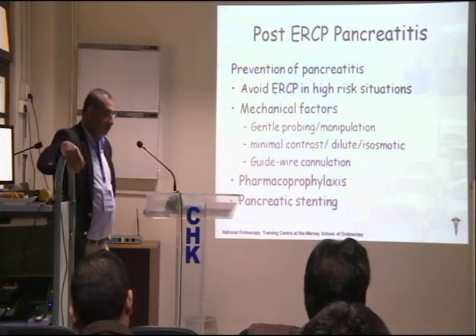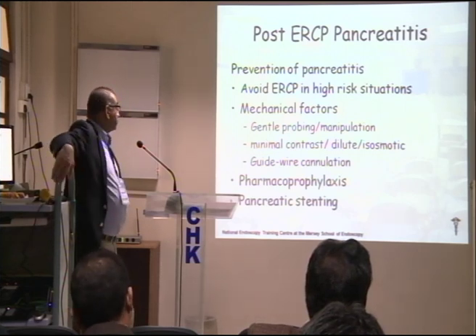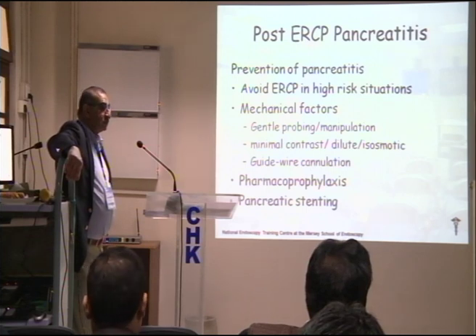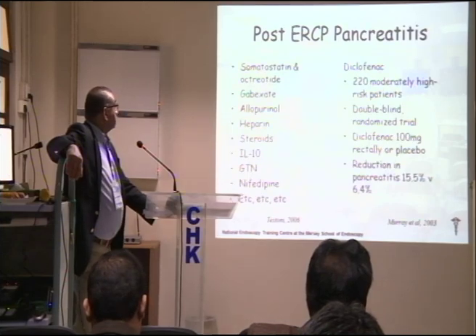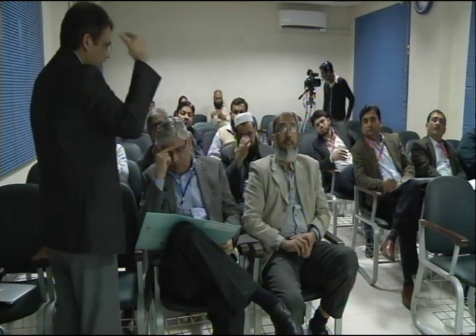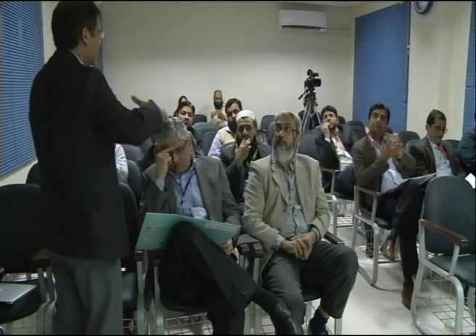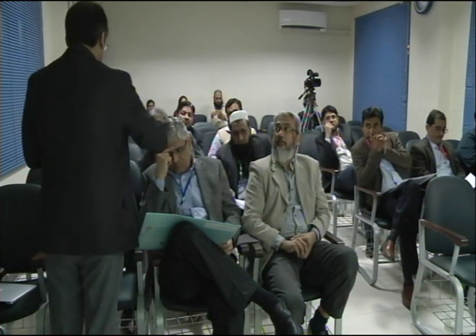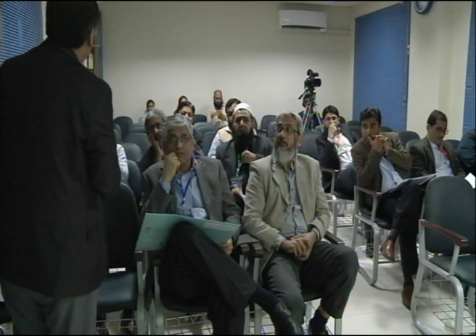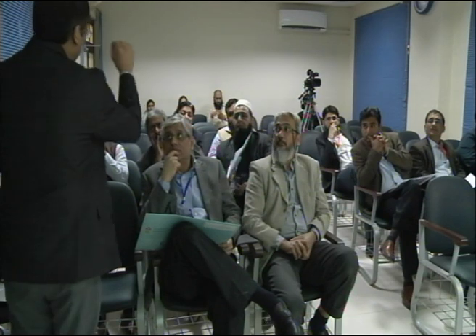So whenever you think about post-ERCP pancreatitis, it's not just how many attempts you did on the pancreas, how many times you put the wire in there. It's mainly 2 things you have to look at before you make a decision about putting a stent in the pancreas, or start thinking about whether it is a high-risk post-ERCP pancreatitis or not. One is the patient factor, and the other is the procedure factor. So just saying, oh, I went into the pancreatic duct 3 times, I gotta put a stent in there. Okay, you went into the pancreatic duct 3 times, you put the cannula.